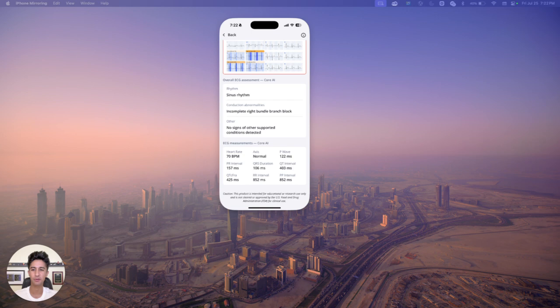In the EU, it is actually a Class 2B device, and I have the page pulled up here. Basically, a Class 2B device is slightly more complex than Class 2A devices, generally medium to high risk, and will often be devices installed in the body for periods of 30 days or longer. So pretty advanced devices, so I imagine they're probably working on getting US authorization.